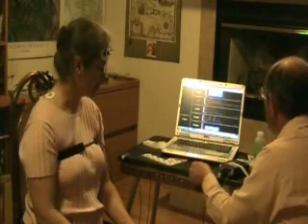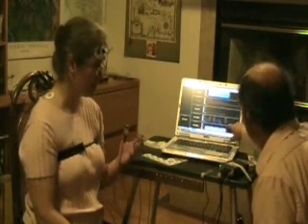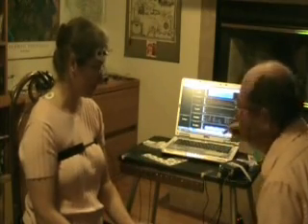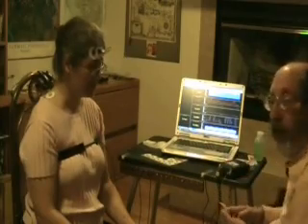Okay, I tell you what, Barb, move around, move your hand a little bit. You see what happens there? You get a terrible recording when someone moves. This is very sensitive to movement artifacts.